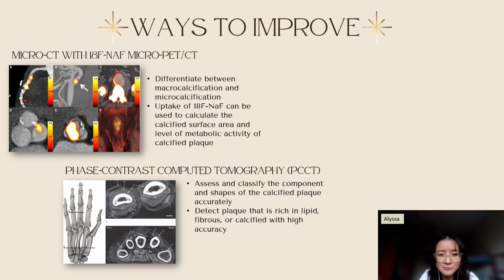And lastly, we can also use phase contrast computed tomography because this method can assess and classify the components and shapes of the calcified plaque accurately, as well as detect plaque that is rich in lipid, fibrous, or calcified with high accuracy.